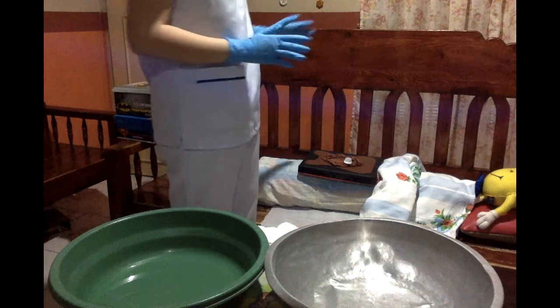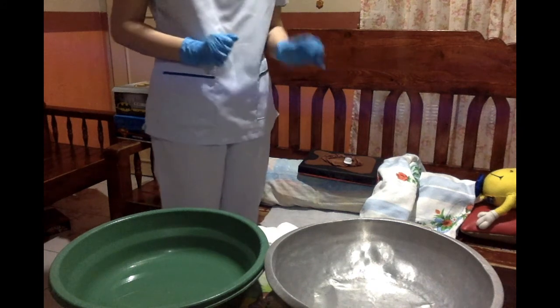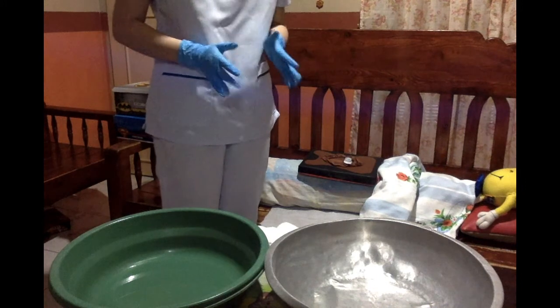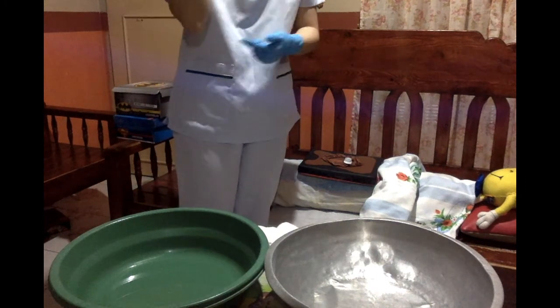I will now be washing the genital area of the patient. But first, I will check the temperature, and the temperature must be warm. I will check it using my elbow.